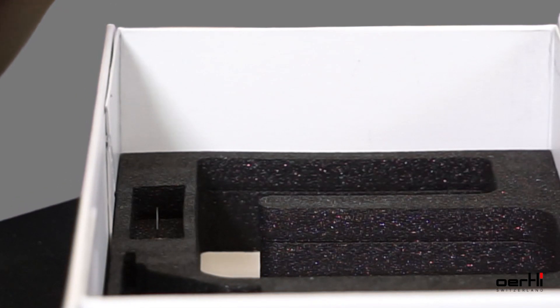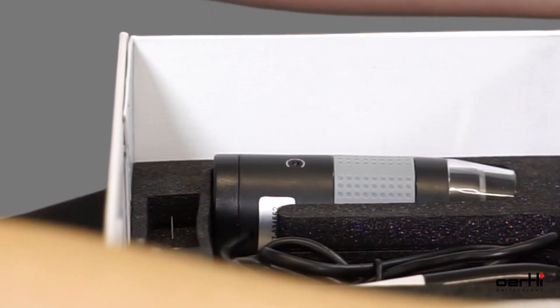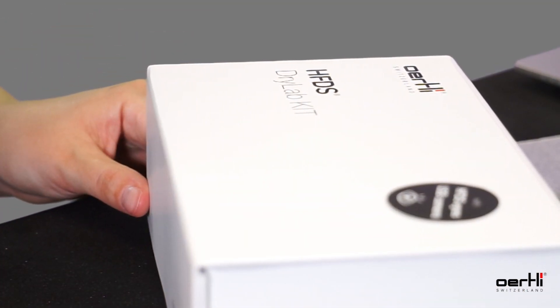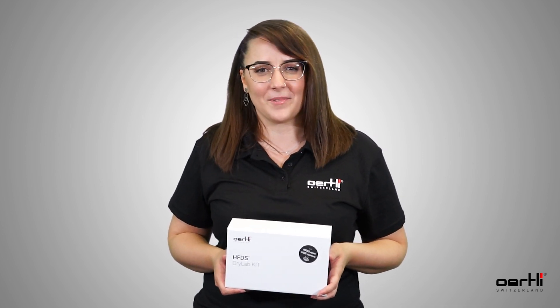Tip: rinse the cannula with water to avoid drying of the viscoelastic substance. Finally, everything can be easily stored in the box again. Now it's your turn — make the difference with the HFDS dry lab kit.